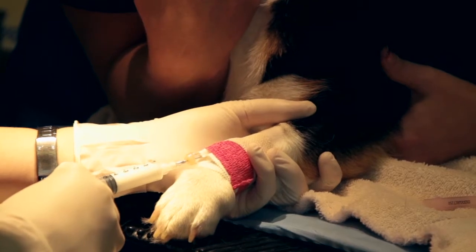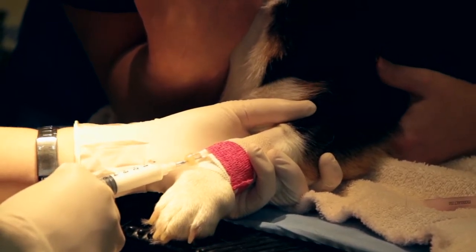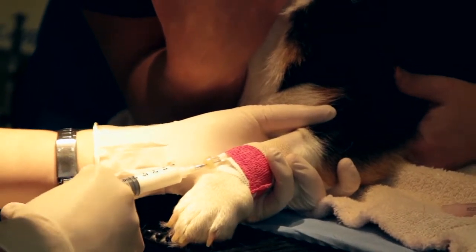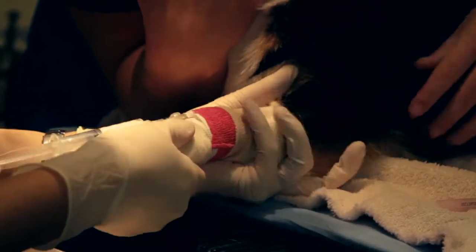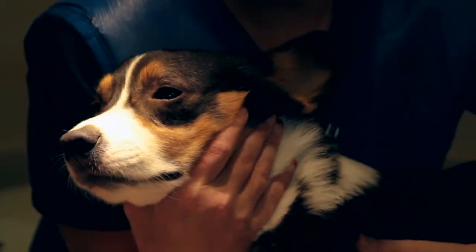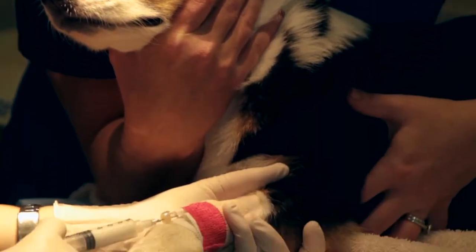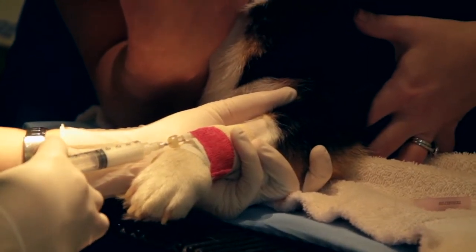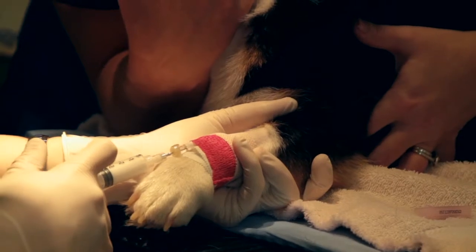We give no more or no less than is needed to get the patient in a state where we can continue with the procedure. And you'll see that they're going to give a little bit and wait. They're going to check some blink reflexes. In a minute, Miss Chiquita will try to open SNAP's mouth and see if there's resistance. So it's just a slow procedure.